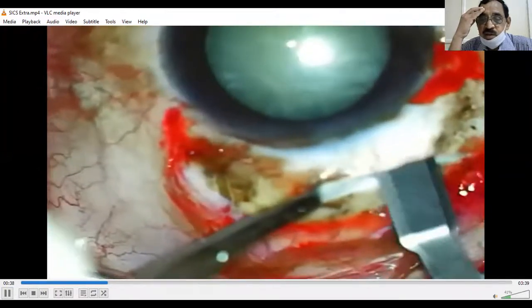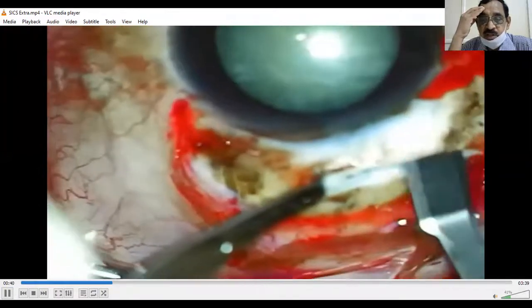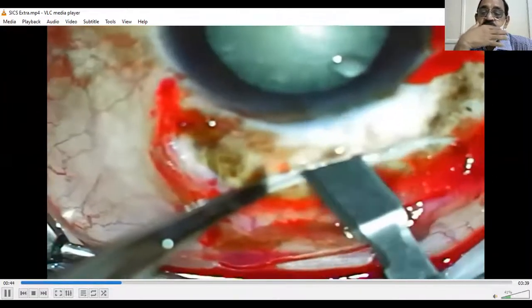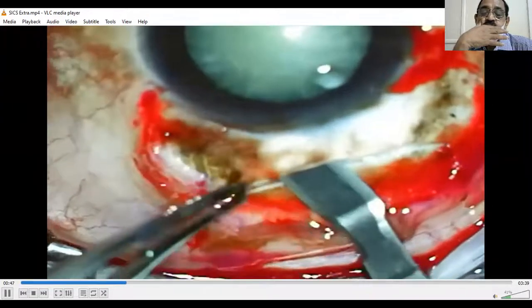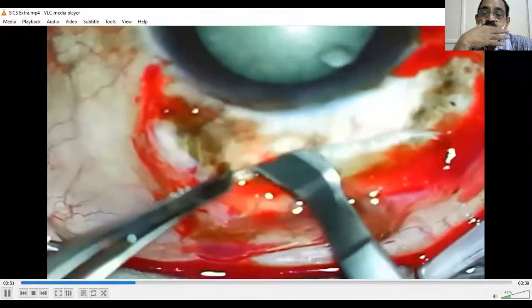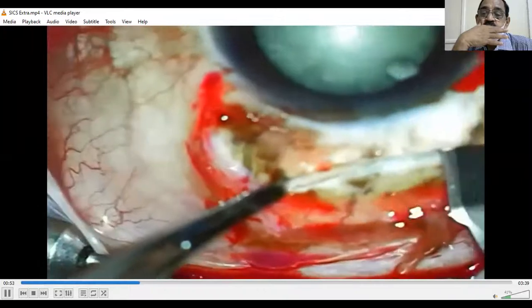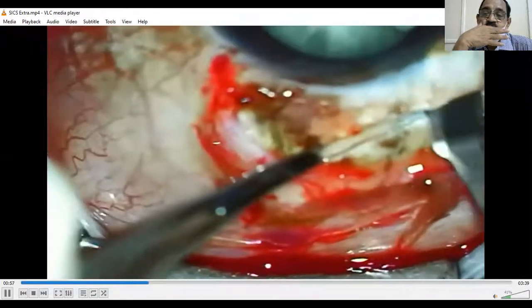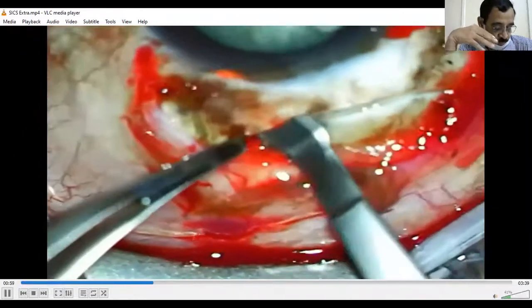The crescent blade is then used to tunnel towards the clear cornea, keeping in that same plane. It's very important not to become too superficial or too deep, as this would result in premature entry into the anterior chamber and potentially iris prolapse during the case. To ensure that this incision closes without sutures, it's important to make sure that it is wider internally than externally.